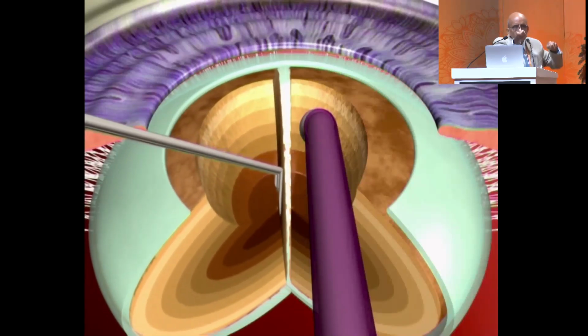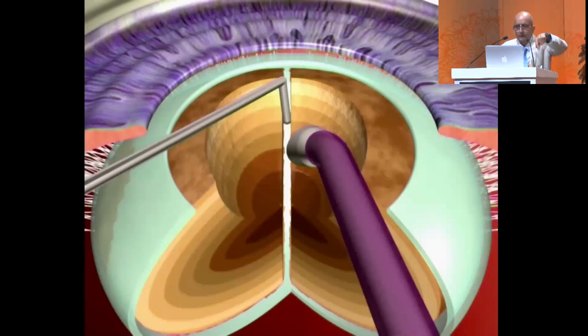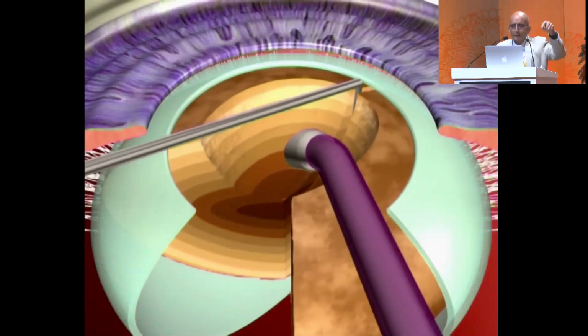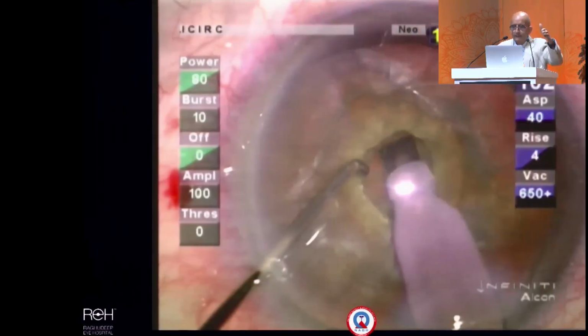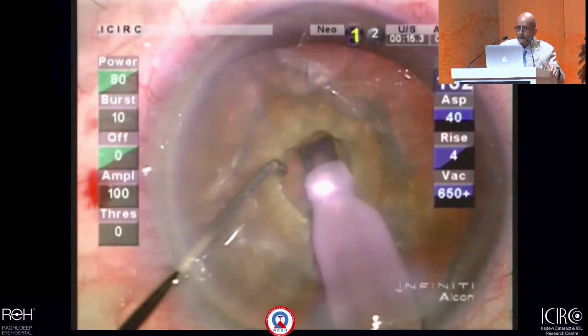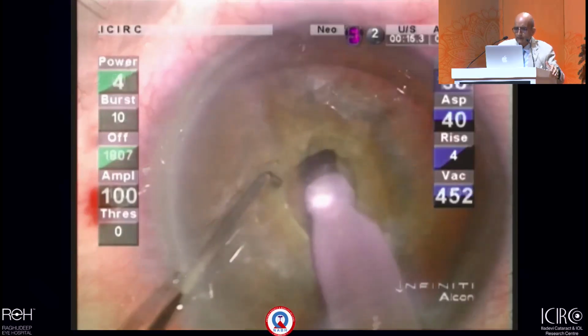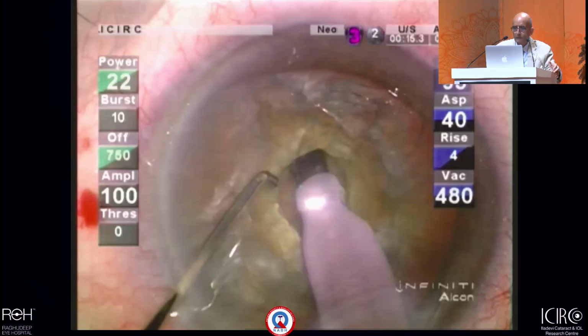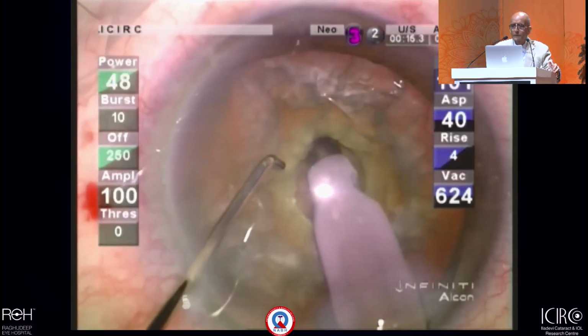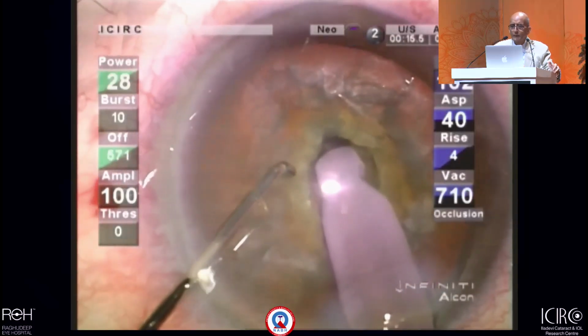The whole lens tilts in horizontal, and there you can repress. So create a crack, place the chopper into the depth of the crack you created. Once again, repeat the maneuver. So progressively, in a step-by-step manner, take that thing that you created. And notice here that the vacuum will go to the highest. The foot pedal is in third position. And once it occludes completely, you want to come off to the second position. The 3 figure will become 2.